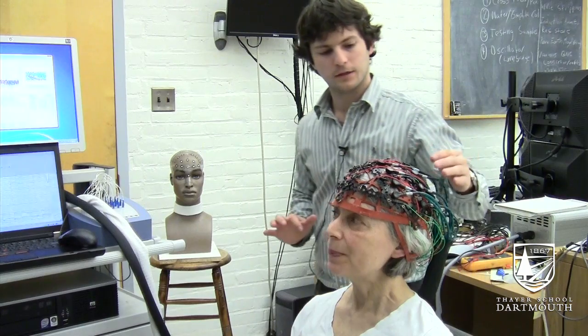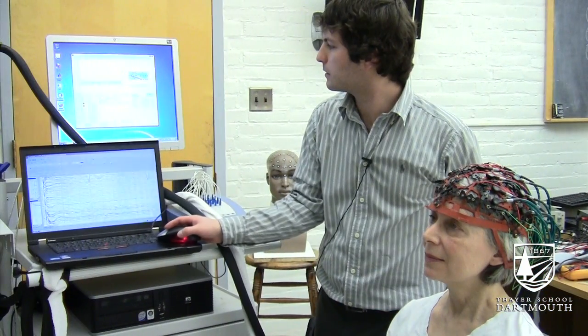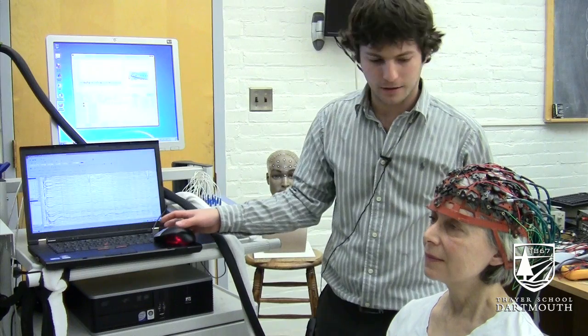Alright, it's all set. So I'm going to turn on the lasers now and there we go.